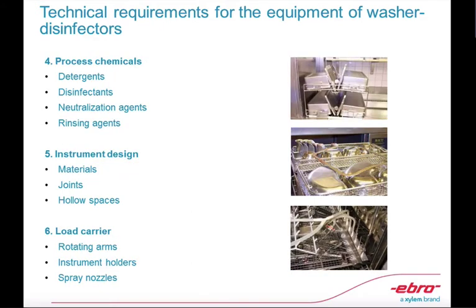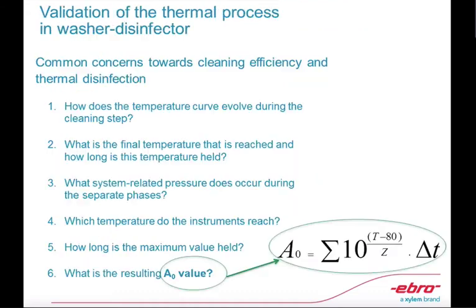And number 4, the process chemicals: detergents, disinfectants, and other compounds. And this is why it is very important for our routine control and validation to use conductivity meters. Then instrument design, and lastly the load carrier, which refers to the mechanical parts of the washer disinfectors.